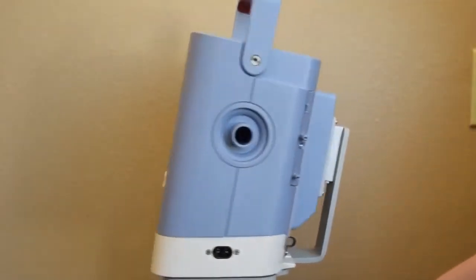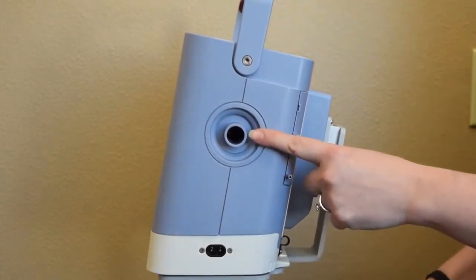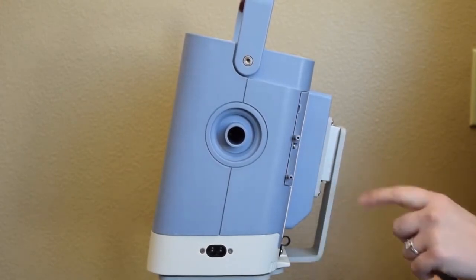For your side panel, we have our AC power cord inlet, our breathing circuit connection, and then our pressure line and exhalation valve lines for your active circuit port.